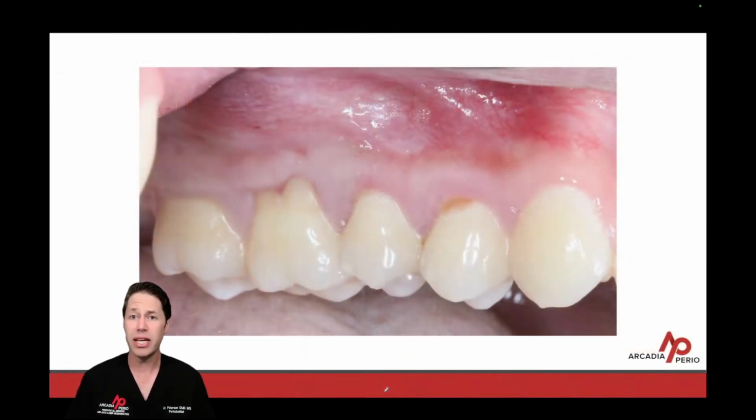So Kevin referred this case over to me. A mucogingival defect on tooth number 3, with the localized facial recession and early furcation involvement. This is a kid who is approximately 18 to 20 years old. I can't remember the exact age, but let's look at this case. Let's look at the clinical photograph and let me draw on this and let me show you what I am seeing.